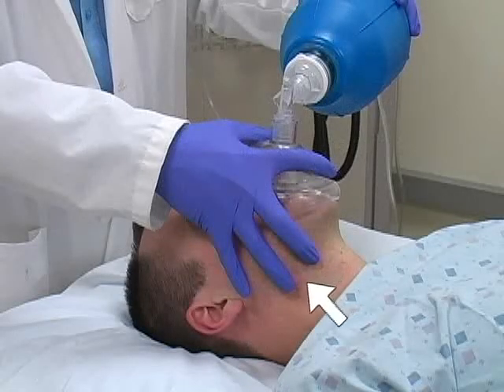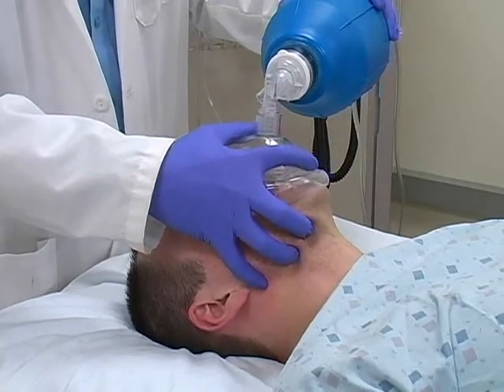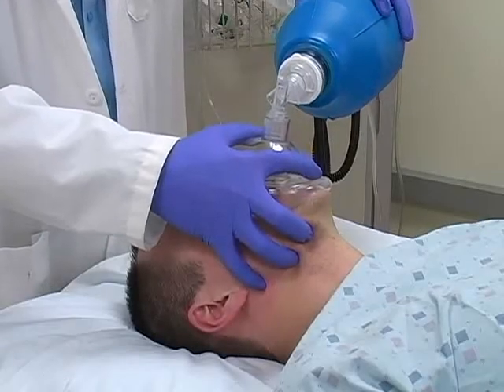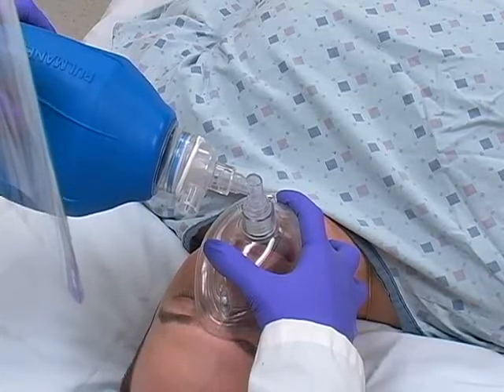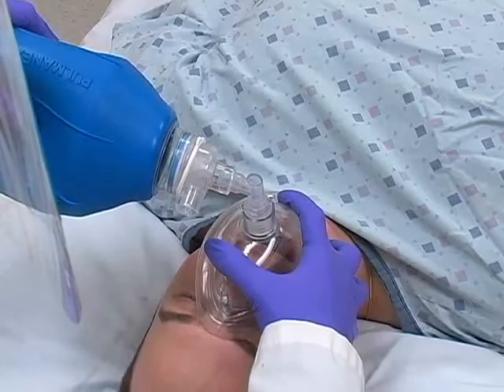Place your middle, ring, and little fingers along the underside of the patient's mandible and pull it upwards into the mask. This maneuver is analogous to the head tilt chin lift technique, and it further opens the airway. While these fingers maintain upward traction on the mandible, the thumb and index finger hold the mask tightly to the face and ensure a proper mask seal.